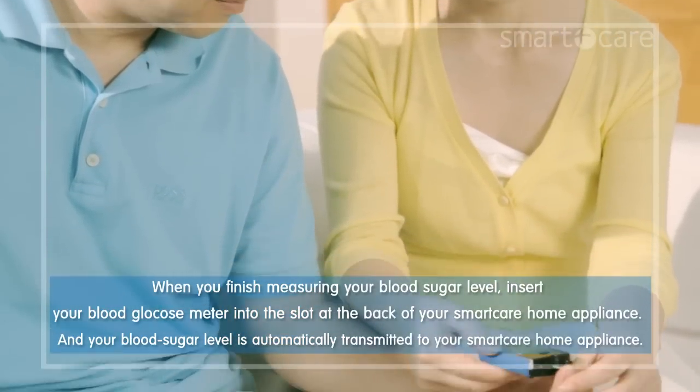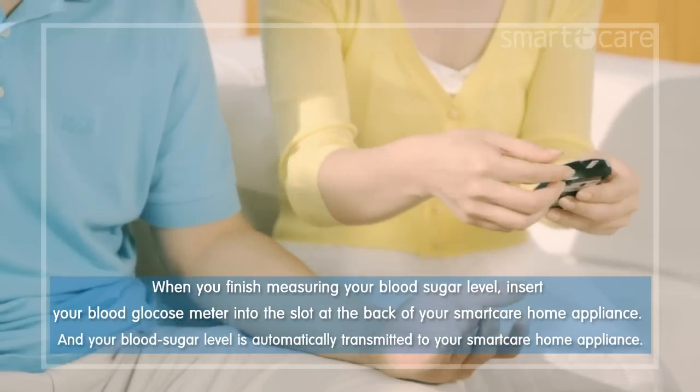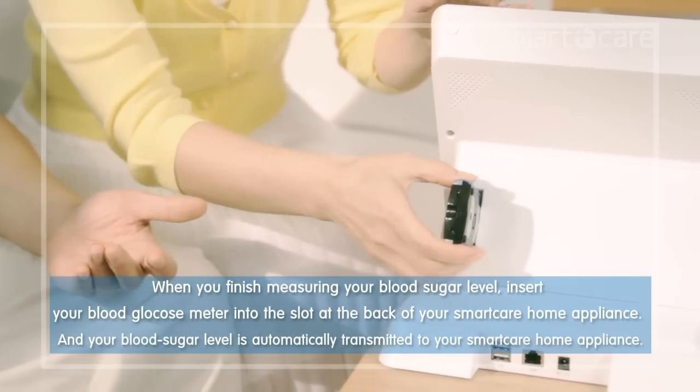When you finish measuring your blood sugar level, insert your glucose meter into the slot at the back of your smart care home appliance, and your blood sugar level is automatically transmitted to your smart care home appliance.